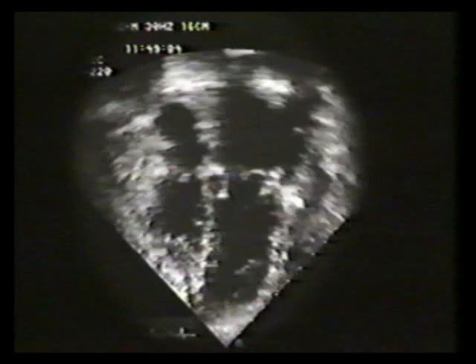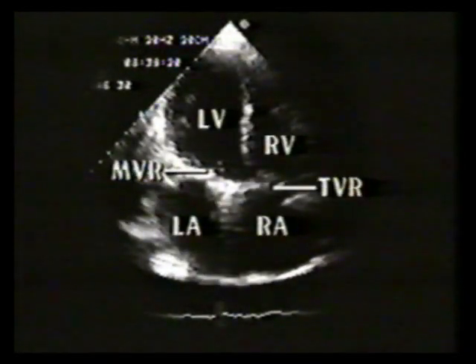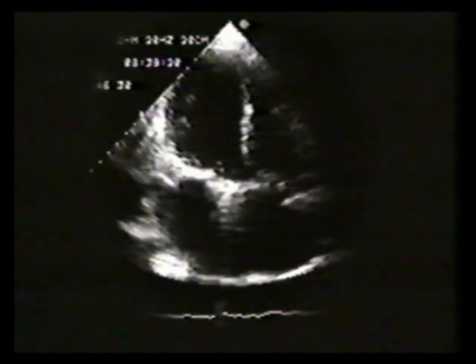Here, left ventricular size and function are normal. The left atrium is moderately enlarged and free of thrombus. This is the 42-year-old female whose mitral Bjork-Shiley prosthesis was previously demonstrated. At this time, we want to direct your attention to the normal Ionescu-Shiley heterograft prosthesis in the tricuspid position.